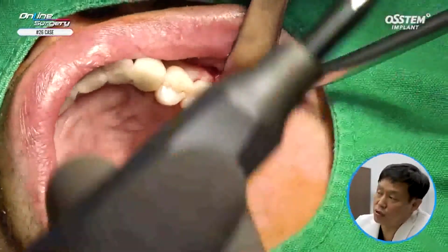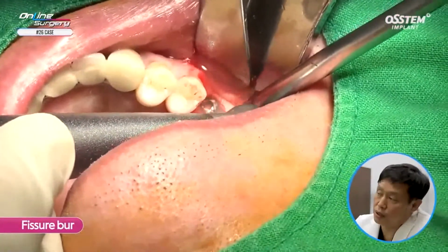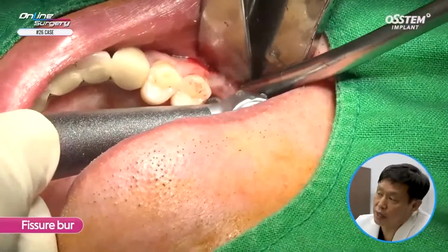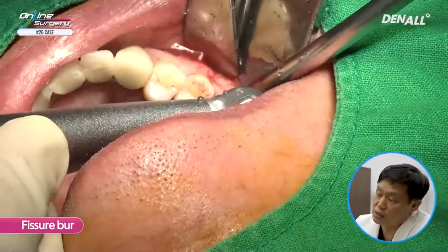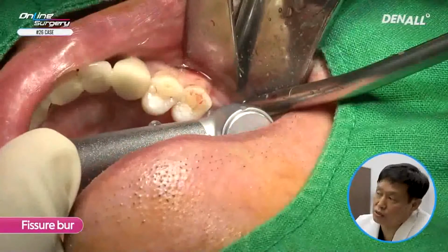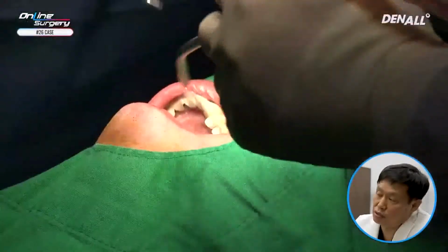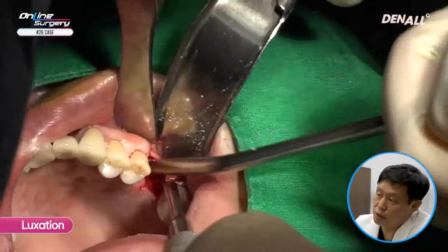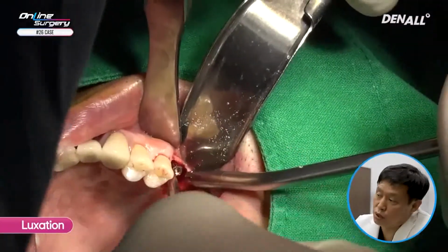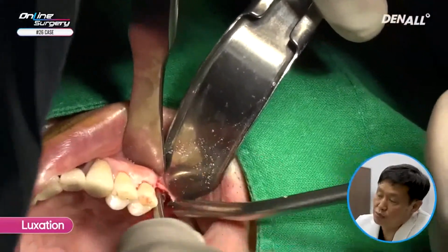It's not easily luxated. I'm going to use the fissure bur once again. I'm going to remove the alveolar bone more deeply so that a fulcrum can be gained mesiodistally. I'm going to try to avoid buccal plate damage as much as possible. I'm going to use the elevator to luxate it. You can see that it is slightly moving.